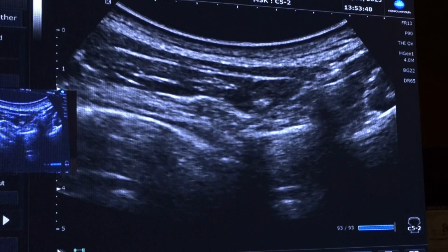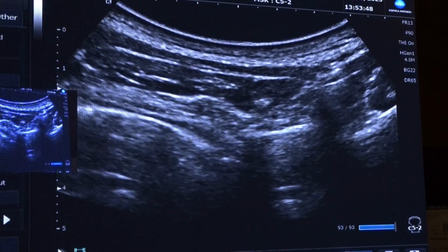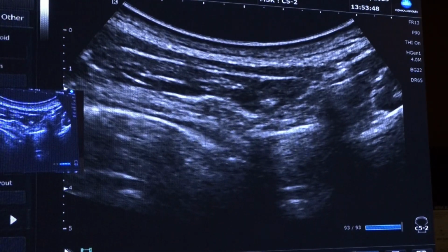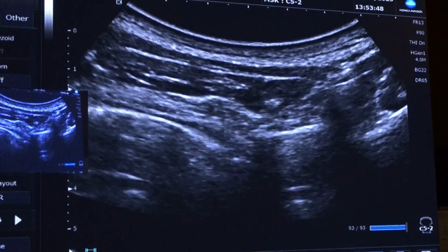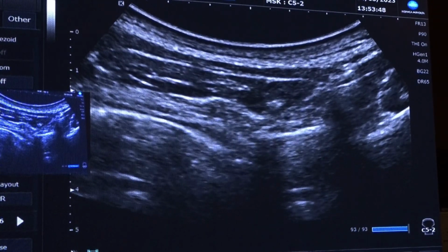Now I don't say that this should be your first line of attack for any thoracic cases. Your paravertebral injections work very well. We don't know how these blocks work. They are technically very simple because you don't even need to identify whatever. But I showed you can identify a lot of these things. And if you can place your needle here and inject your local anesthetic, then some of this local will get into the thorax, into the epidural space, paravertebral space.